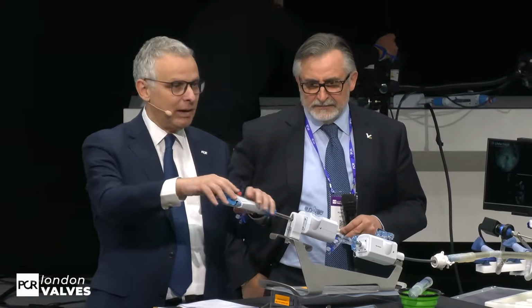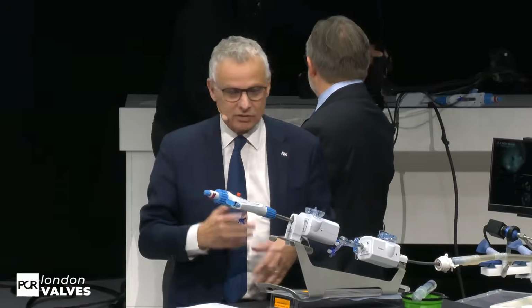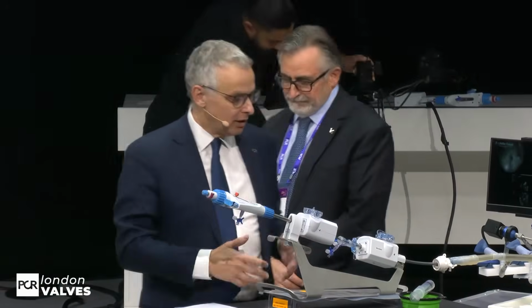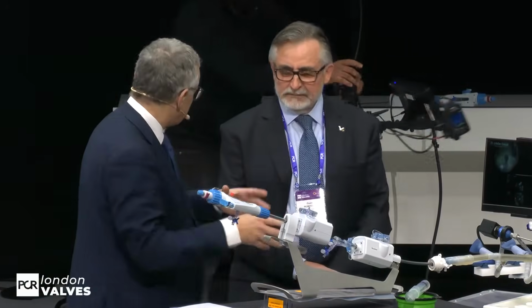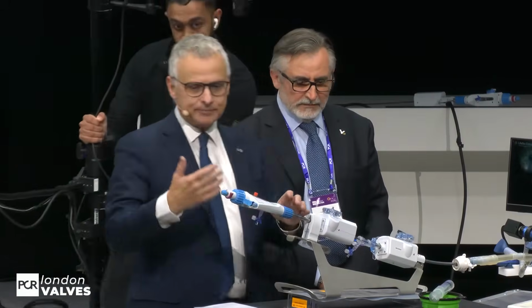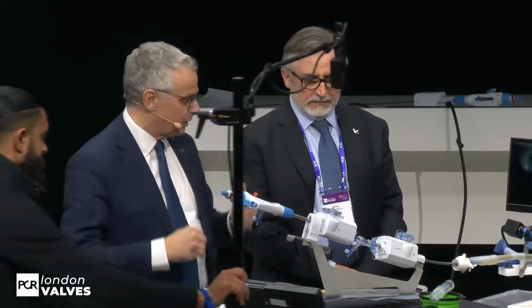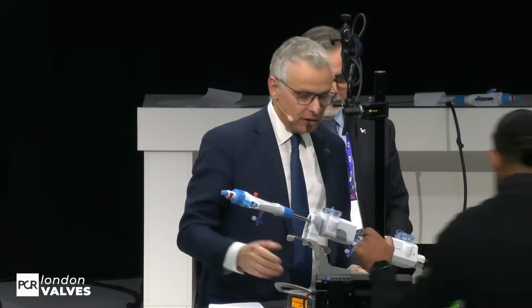The way we manage this delivery system is easier than in the past. It's easier to maneuver and more reliable, with some improvement in the quality of the CDS, and the final release of the clip is easier. Overall, it is an improvement in the handling.